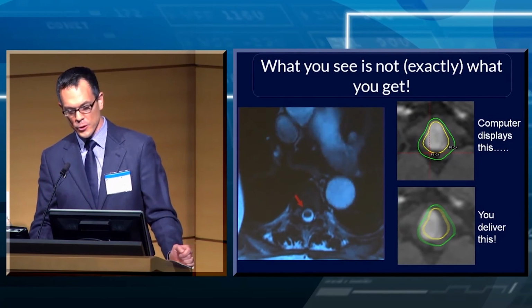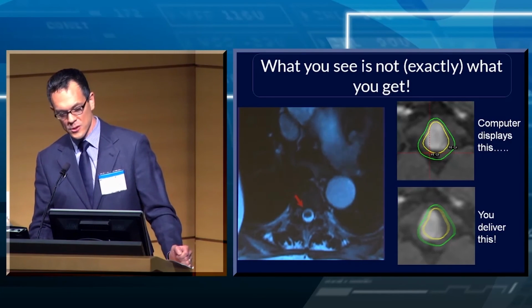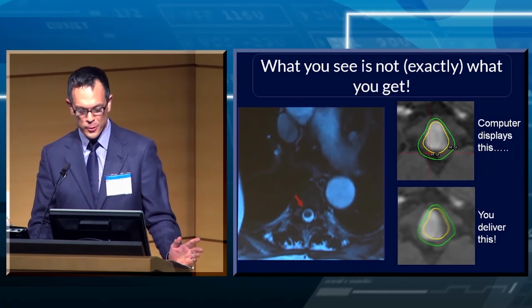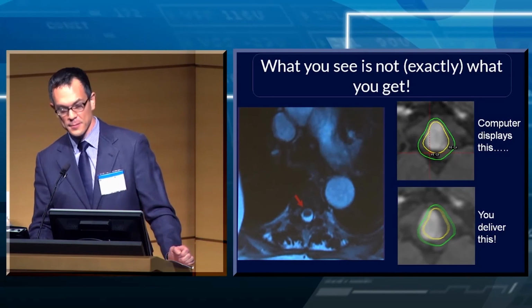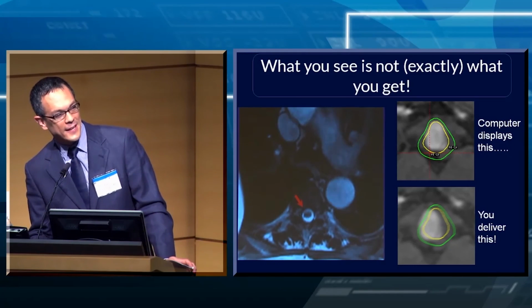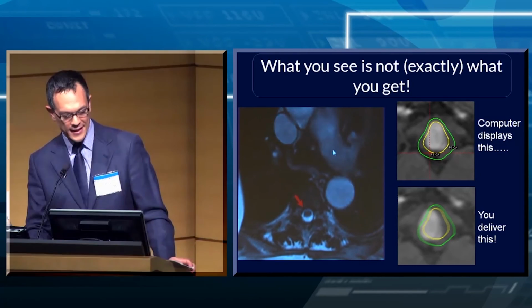And so if your treatment planning computer is displaying some curve that's beautiful and totally covers the tumor, what you're actually delivering is something hopefully not this blurry. This was obviously an exaggeration, but you're not actually delivering the same thing.